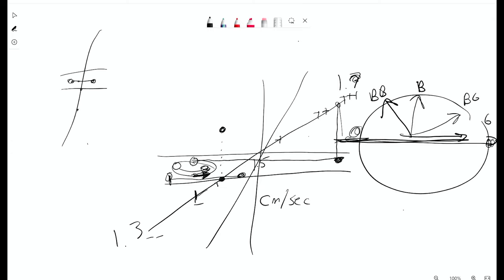Same thing. This one's going to go all the way down. This one's going to go a short distance. This one's going to go medium range. So they actually start out spinning much faster, right? They're seeing a much higher magnetic field strength. So in relationship to this proton that's doing nothing, they're going to spin slower. This guy right here that had a very large difference between the magnetic field strength here and here is going to be much slower. They're not going to be nearly as far around the clock face. This one right here is going to be somewhere around here.